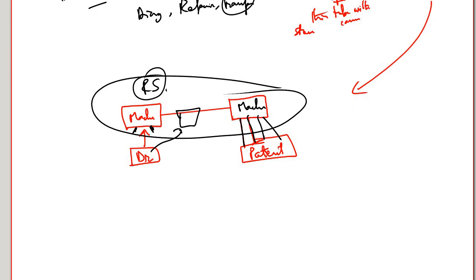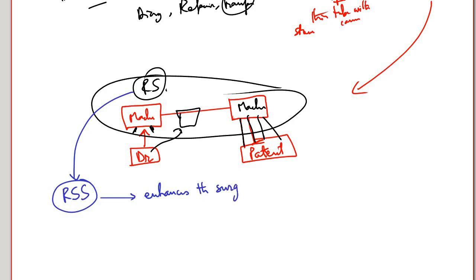So in a single line you can say that this robotic surgical system basically enhances the surgeon's capability for doing the operation, and as a result now the surgeon can do more complex procedures with greater precision.